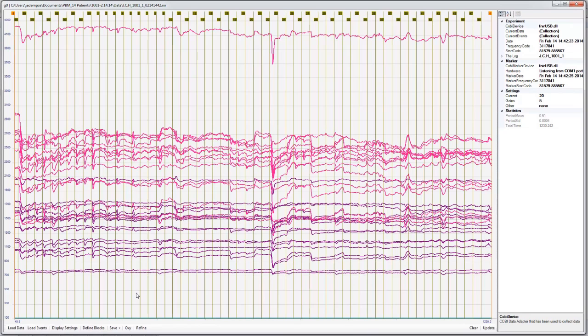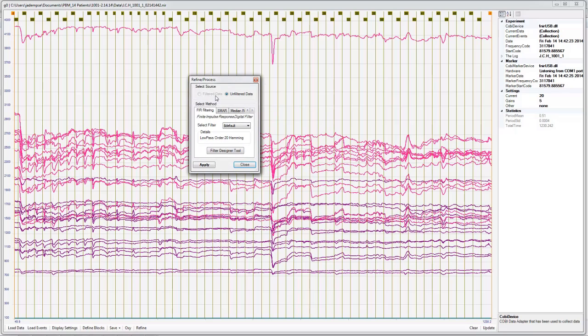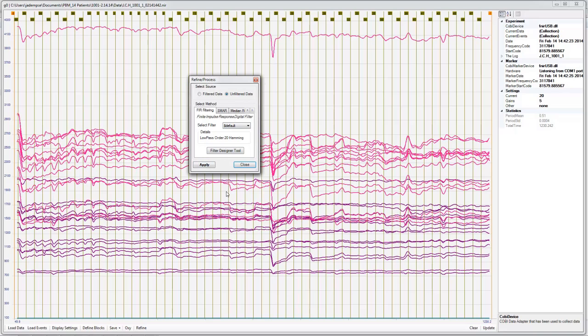What we want to do is clean this data initially. So we're going to click refine, and we're going to use the FIR filter with the default 20 hamming. This is going to take out some of the influence from heart rate and contamination from blood flow movement that is not associated with brain activity. So we click apply. You can see that it cleans up some of the data.